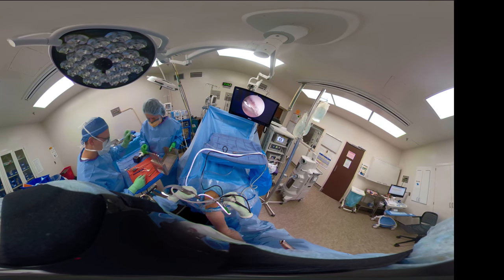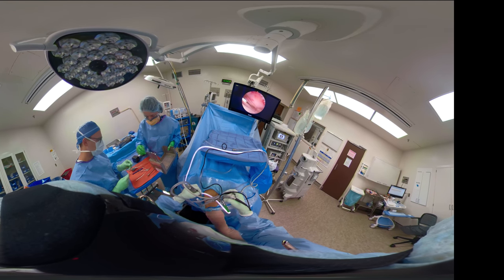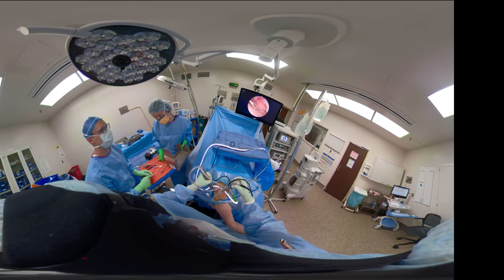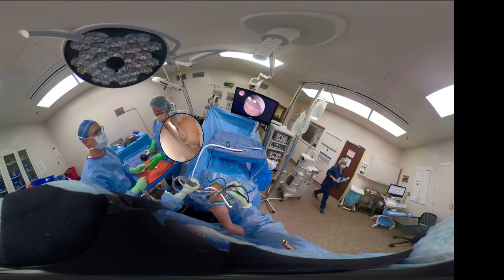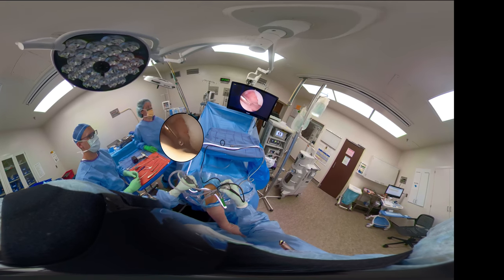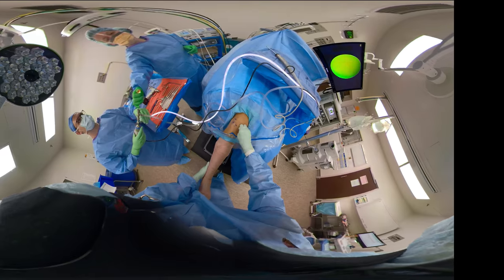And you can see the nice bleeding that's there. Sometimes you need to turn your water off and see how much bleeding there is. I typically do that after we get through with the microfracture. The knee is in 90 degrees of flexion. You see me taking a picture there with the picture popping up there on the left. Now you can see the defect that we have totally prepared.